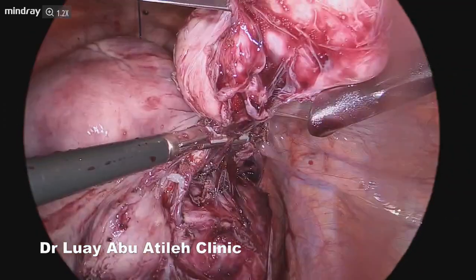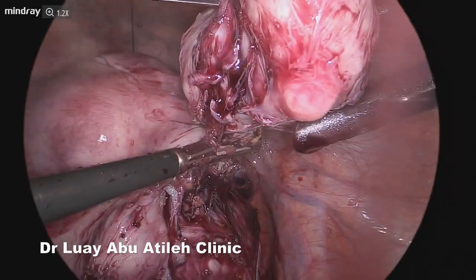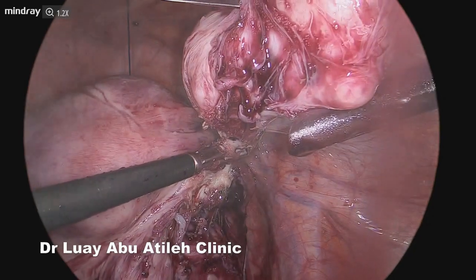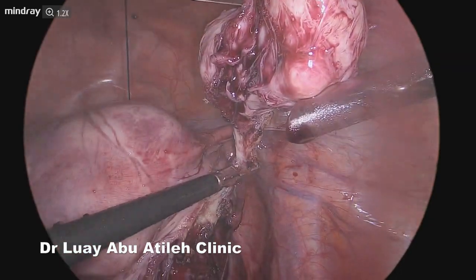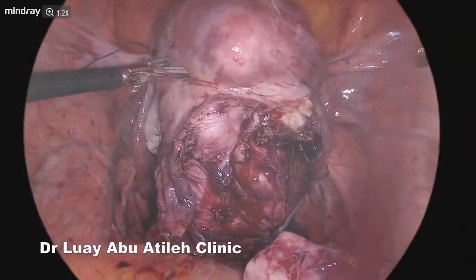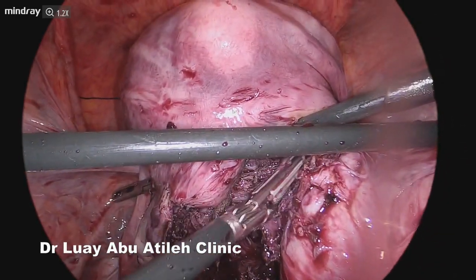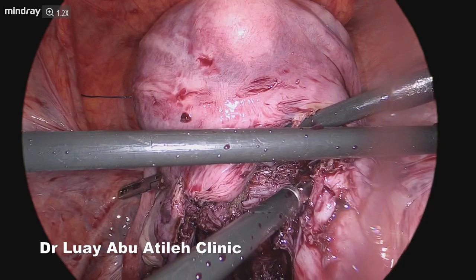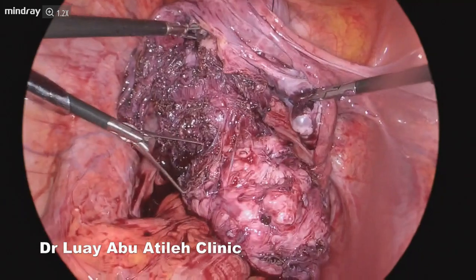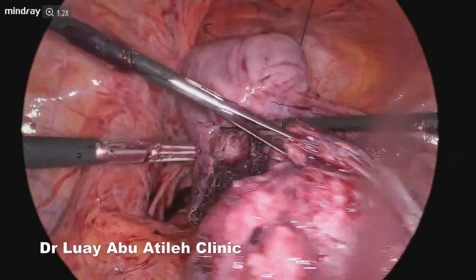The founder of this technique performed a triple tourniquet: the first tourniquet at the isthmic part, as we did, and two additional tourniquets at the infundibulopelvic (IP) ligament, to further decrease the ovarian communication between the ovarian and uterine arteries. However, in this case we did not apply the other two tourniquets, because we wanted to assess the effect of each step alone. If the isthmic tourniquet alone proves convenient and satisfying, I think it will be sufficient in the future.